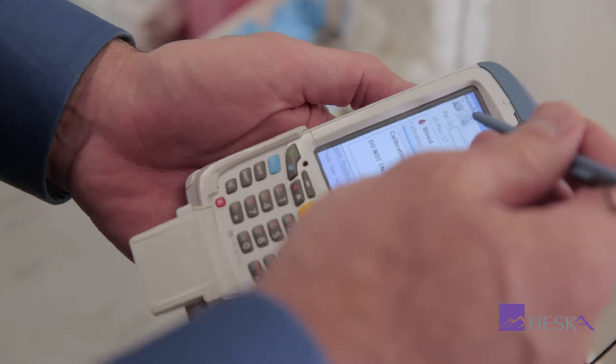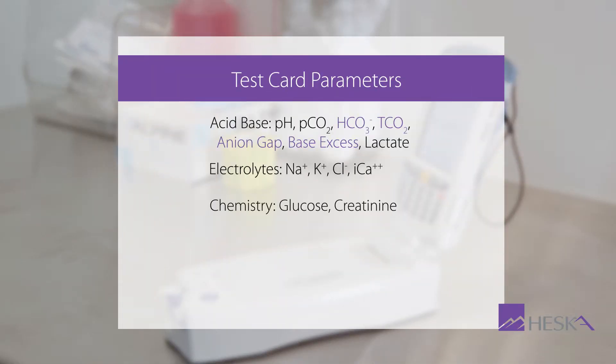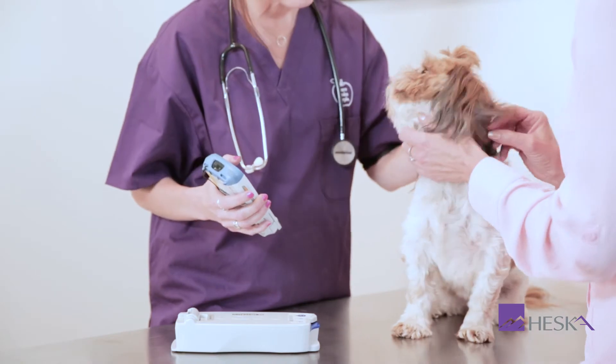Using a single test card, you will have access to critical chemistry, metabolic parameters, electrolytes, hematocrit, blood gas, and acid-base results wherever and whenever you need them.